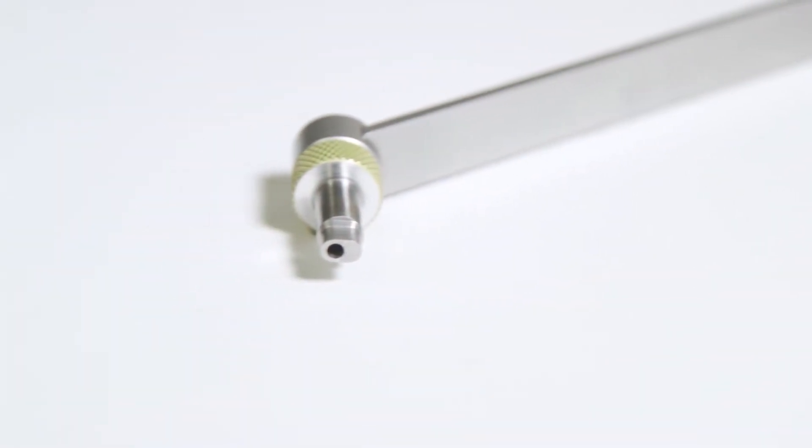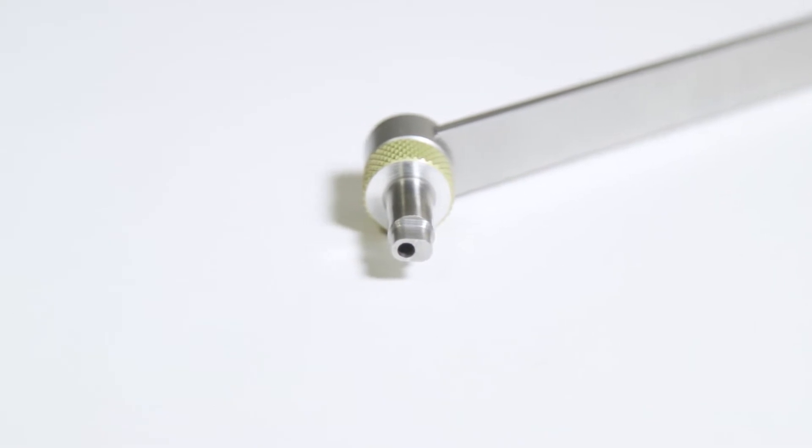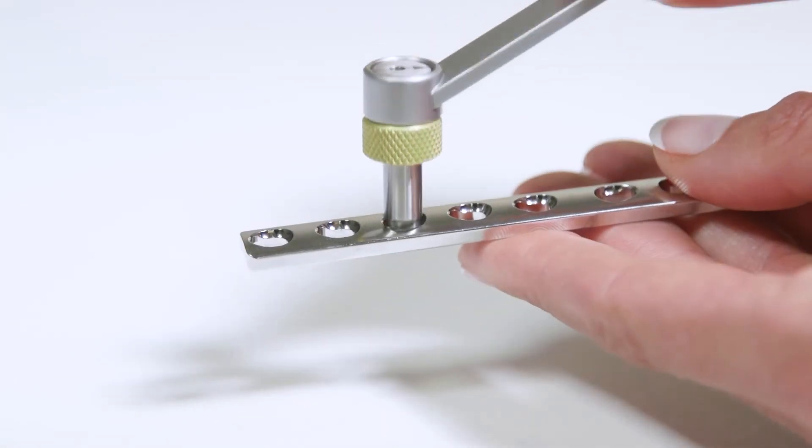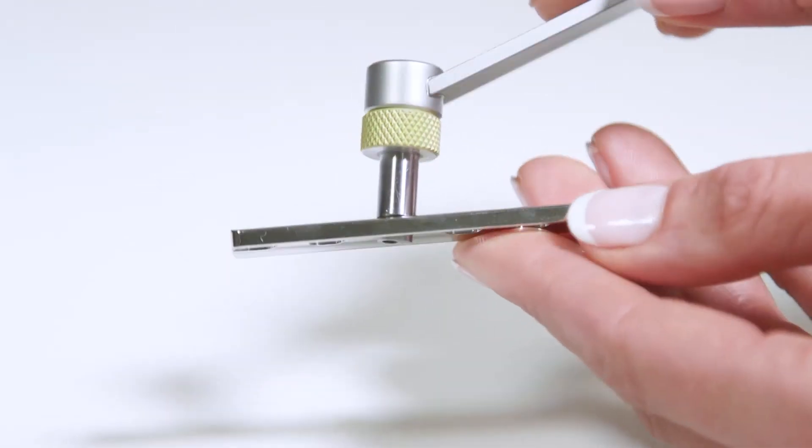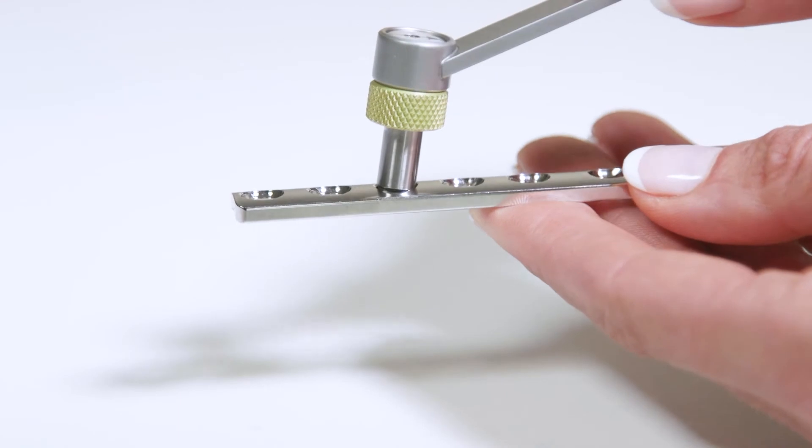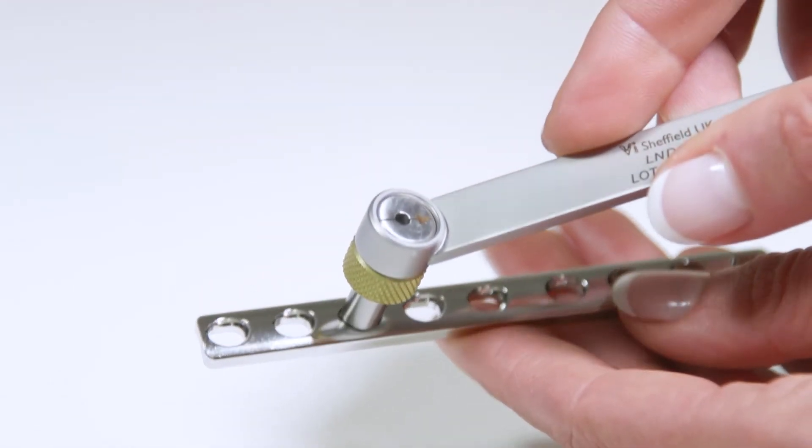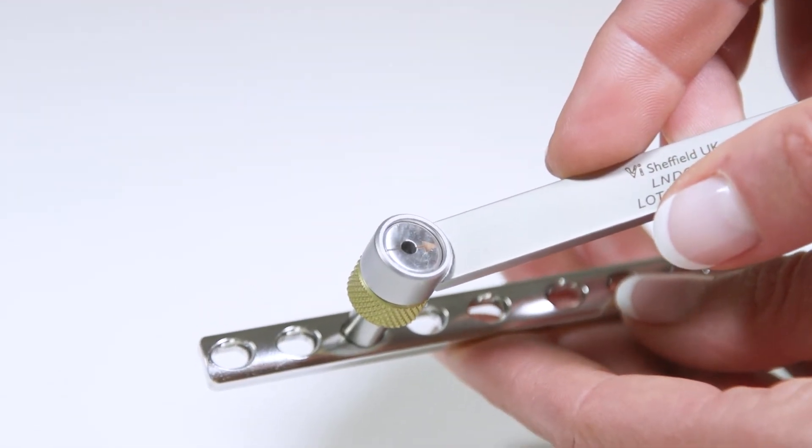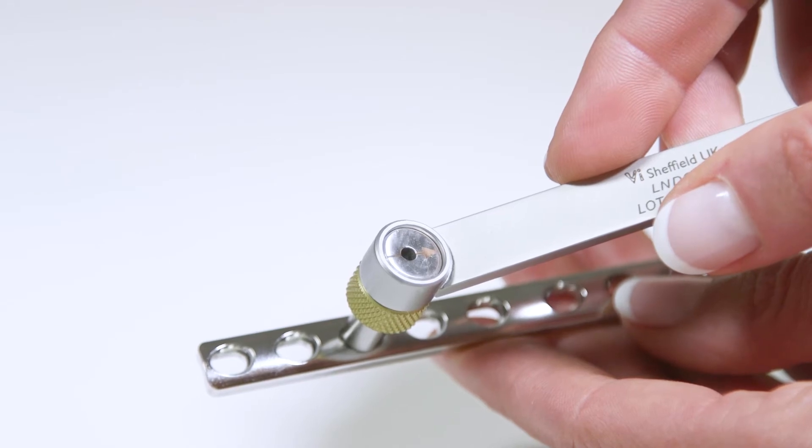One end of the Load Neutral Drill Guide has an offset hole. The tip of the device is positioned to create the pilot hole at the far end of the oval plate hole, away from the fracture. The arrow is positioned so it points towards the fracture. This ensures correct offset positioning of the pilot hole.